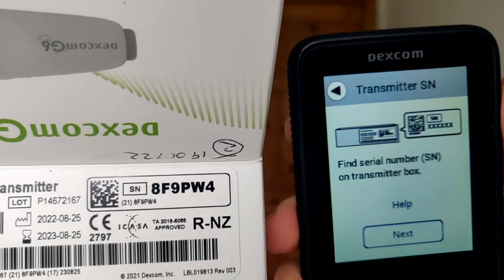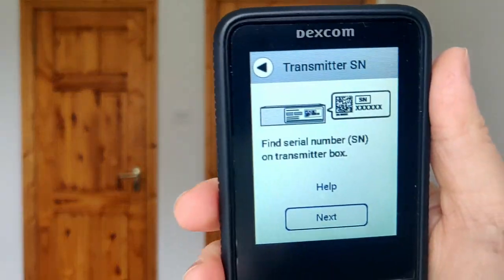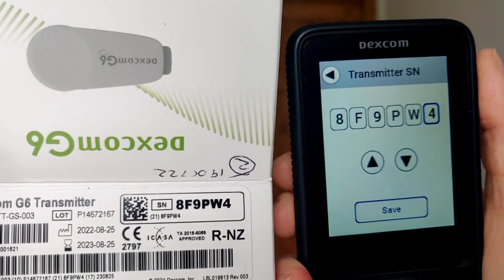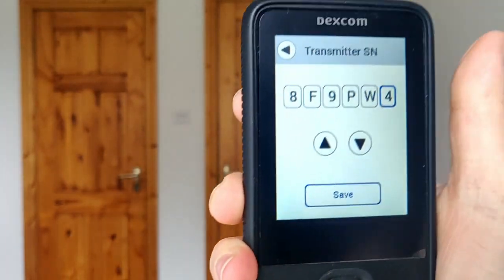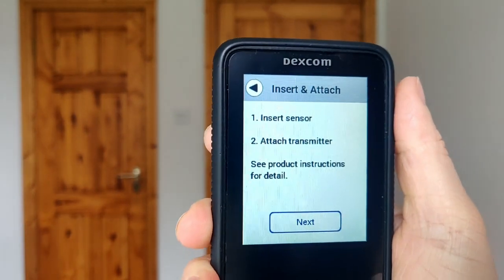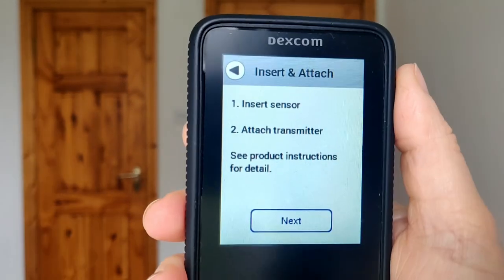It's now asking you to look at the box and get the transmitter code, so definitely hang on to the box when you open it. I enter my transmitter code: 8F9PW4. Double-check it and save. It asks if it's correct — yes — and you want to be sure to get that correct because it's very important.